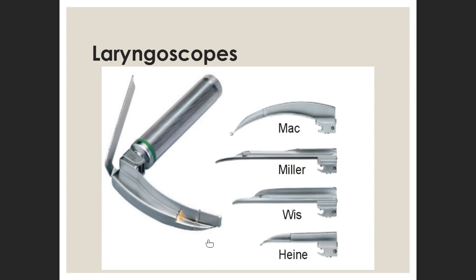So this is the handle with the light source in for the laryngoscope. But when you squash this area, it's connected to the tip and it flips the tip down that way. Gives you added vision. All right. And that's called a McCoy after the person, but it's called an articulated laryngoscope or a hinge tip laryngoscope.